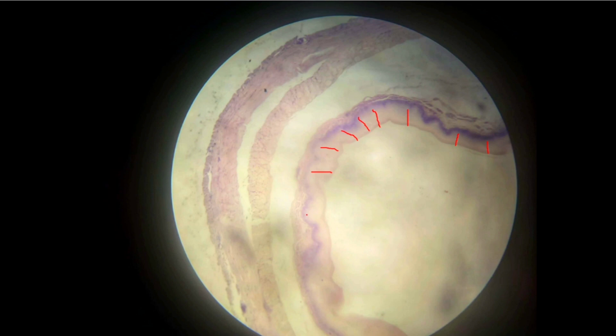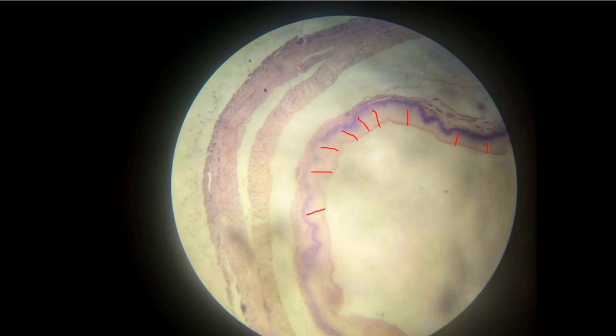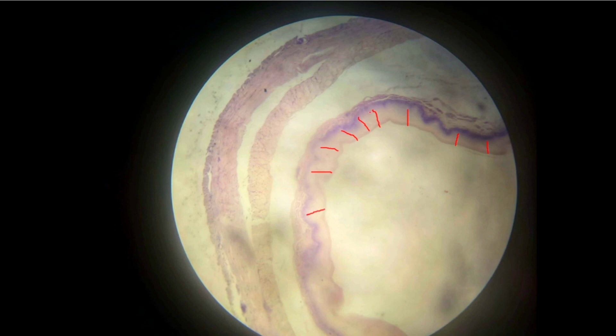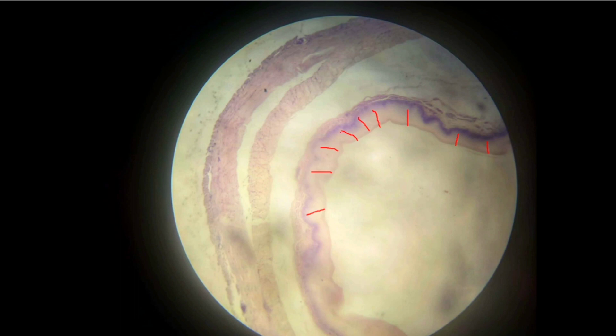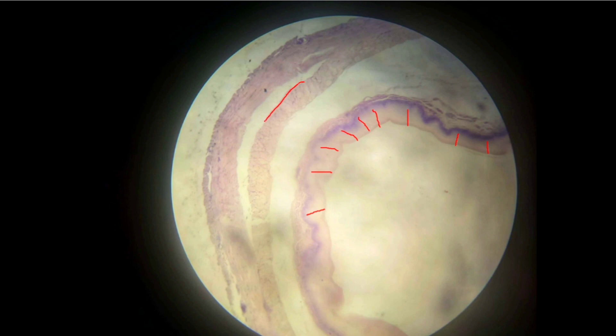So the lining is from the GIT. Which portion is lined by this lining? Esophagus. Esophagus. Very good. This is the slide of esophagus. You can see multiple layers — non-keratinized stratified squamous epithelium. You can see some mucosa. The slide of esophagus.